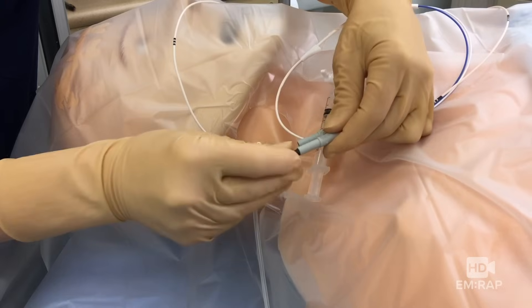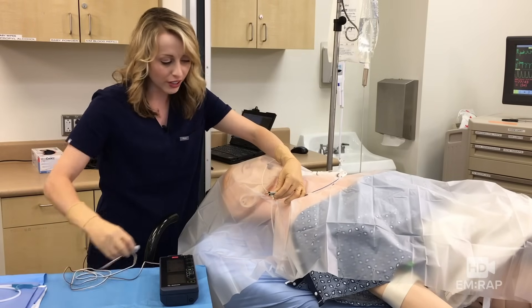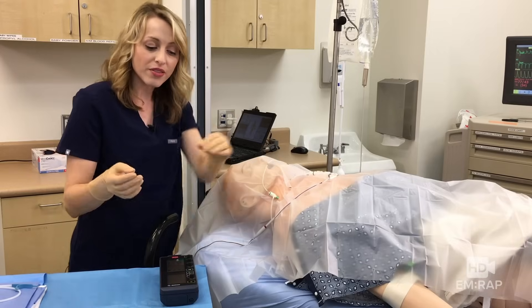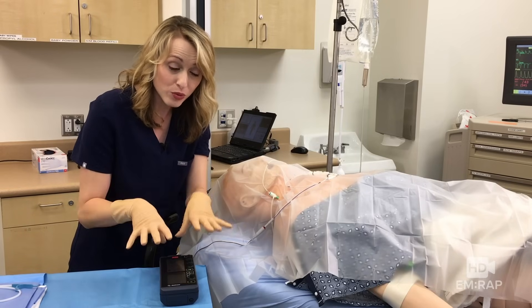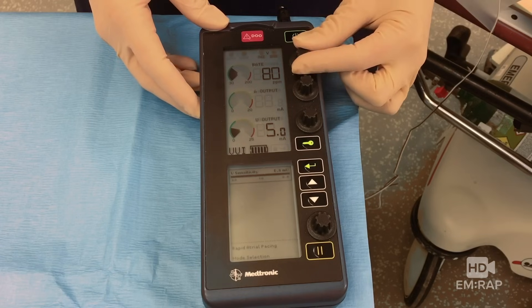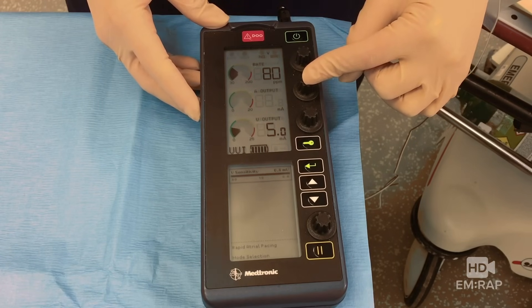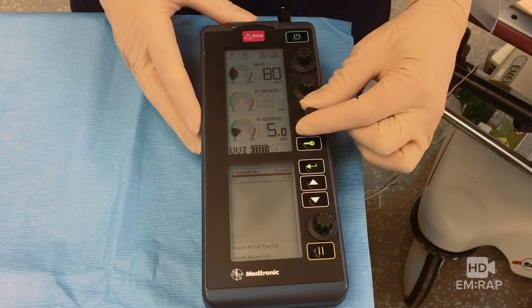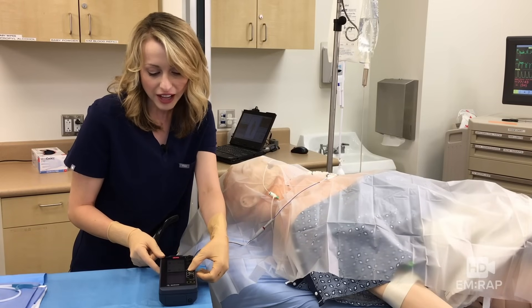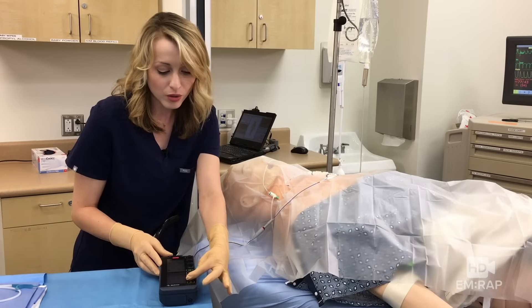Connect the adapter pins to the pacing wire and plug them into the connecting cable — negative to negative, positive to positive. Have your non-sterile assistant turn on the pacing generator. The rate is set to 80; it's okay to go a bit slower since their intrinsic rate will be much slower. We just need to pace the ventricle, not the atrium. The output is set at five milliamps — you can adjust higher if needed. Sensitivity is set at three, but if you're troubleshooting and picking up some intrinsic rate, you can turn sensitivity down to zero.